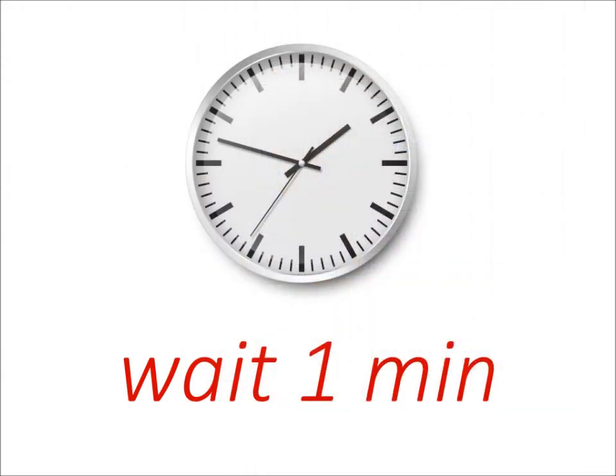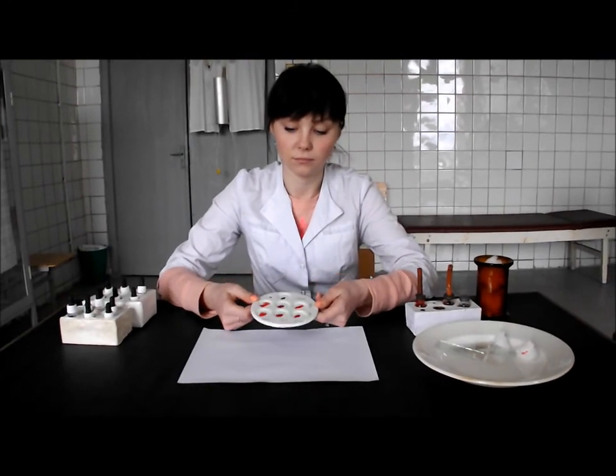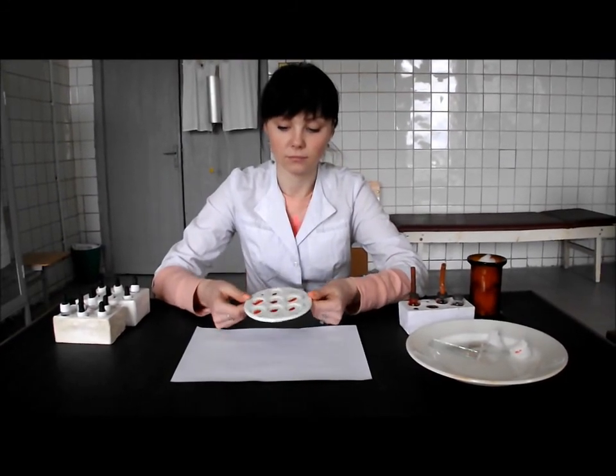Repeat all procedure. If the result is negative, you may make the conclusion that the test blood belongs to the fourth group of the ABO system.